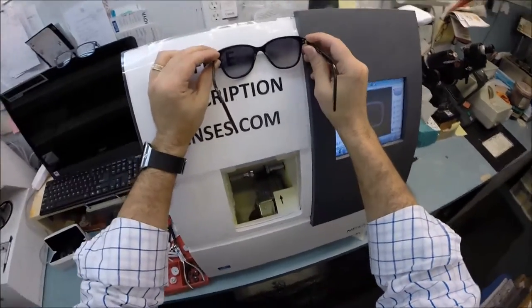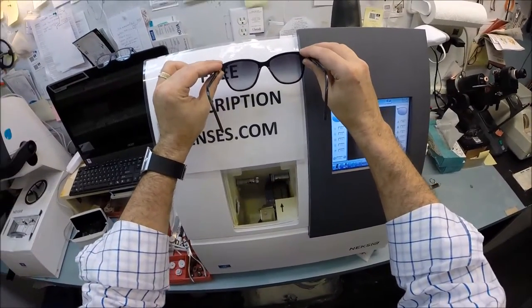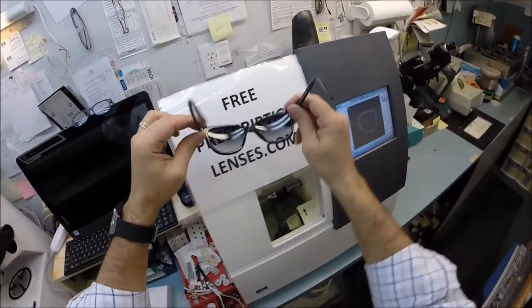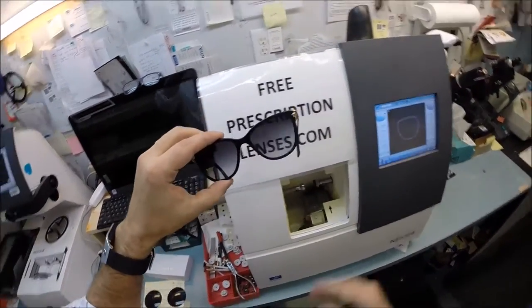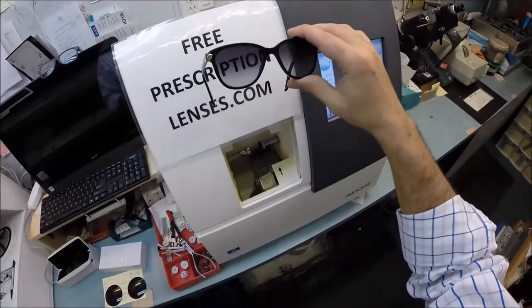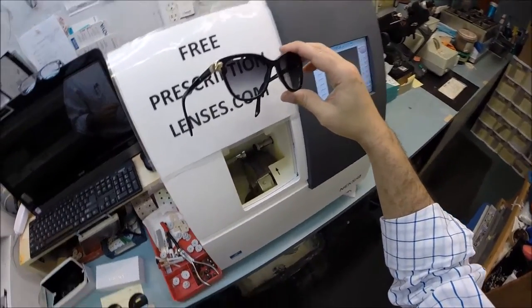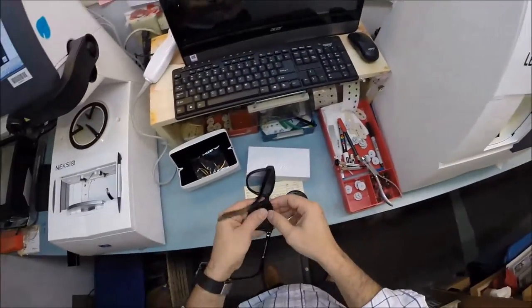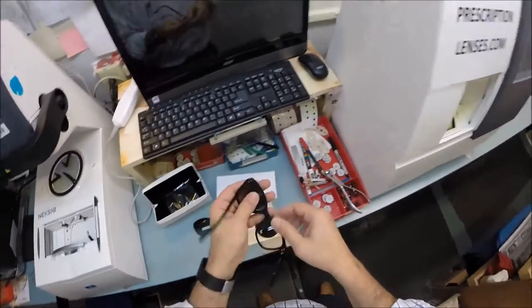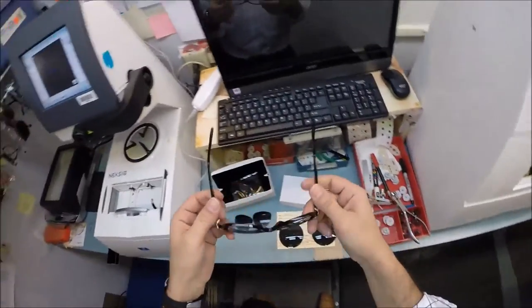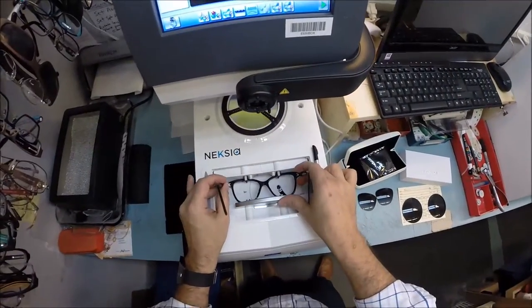Your frame actually comes with a gradient lens, dark at the top that fades to clear, but we're going to put a solid polarized gray lens in there because you're going on vacation later this week. I'm going to take out your original sunglass lenses.